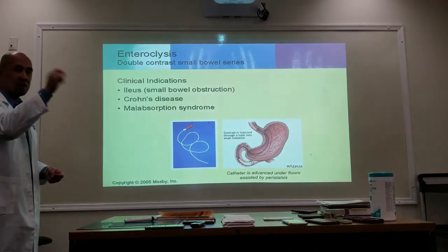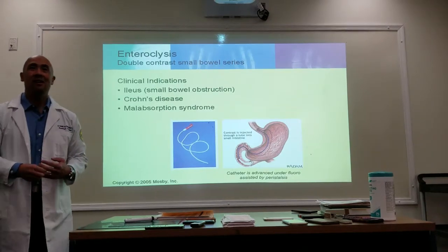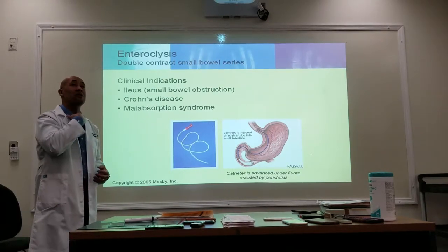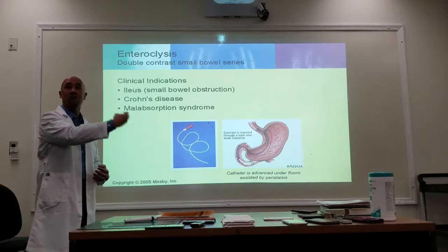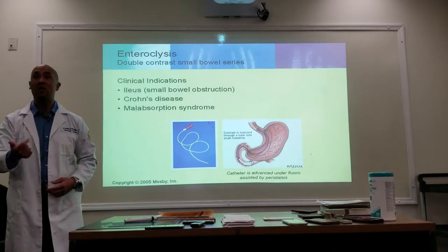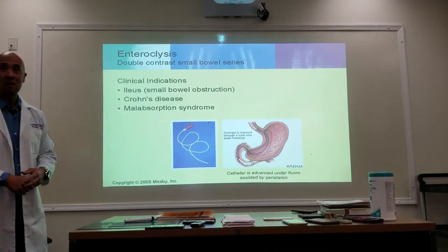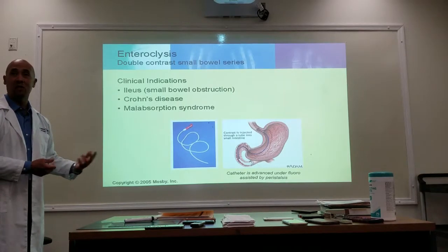Why can't we just blindly put it down there? Lungs. Okay, so remember up here, in the oropharynx there are two openings. One goes to the lungs, the other goes to the stomach. So we do this fluoroscopically to make sure it goes down the right pipe. Because if it ends up in the wrong pipe, now we're shoving contrast down the lungs and we can drown the patient.